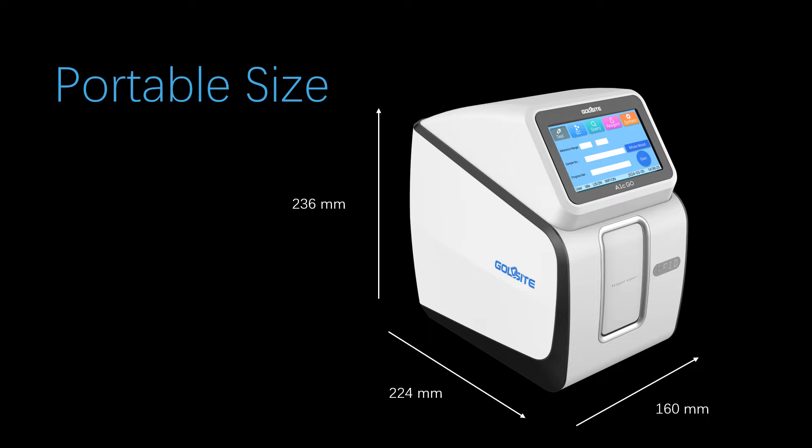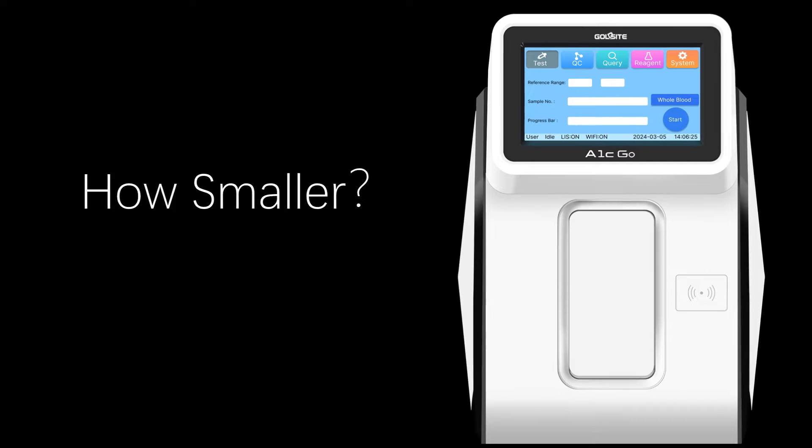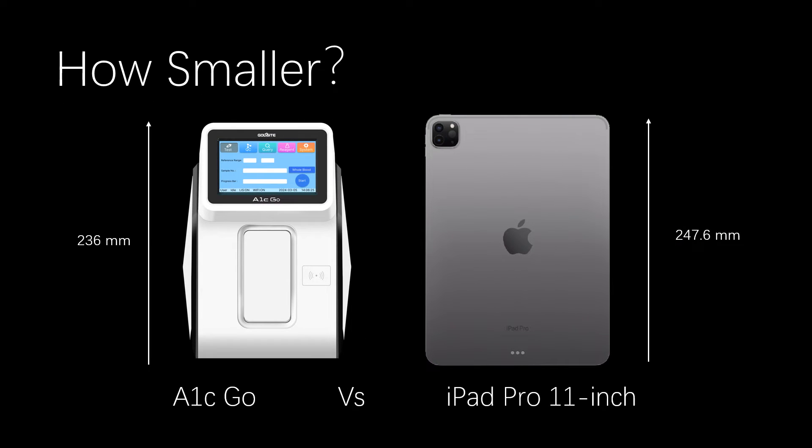It features a compact, portable size. Here is a comparison of its height with an iPad Pro 11-inch, showing how small the analyzer truly is.